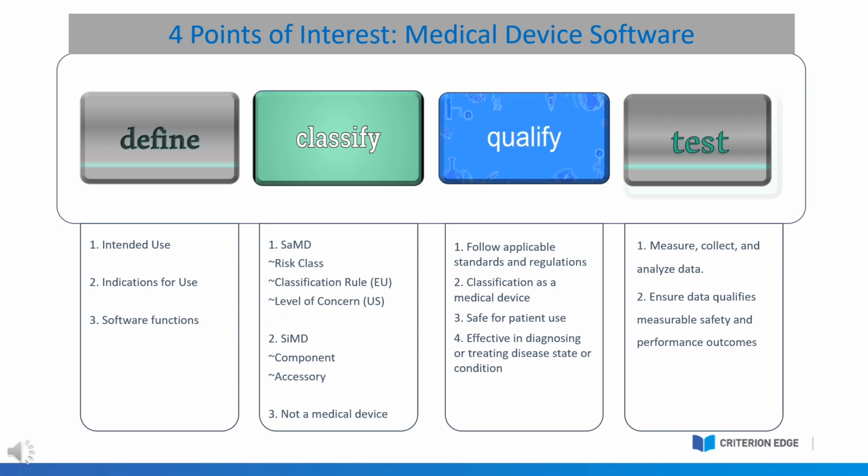Next, you will classify your software. Is it considered software as a medical device that can operate on its own accord, or is the software a component or integral part of another medical device or system?